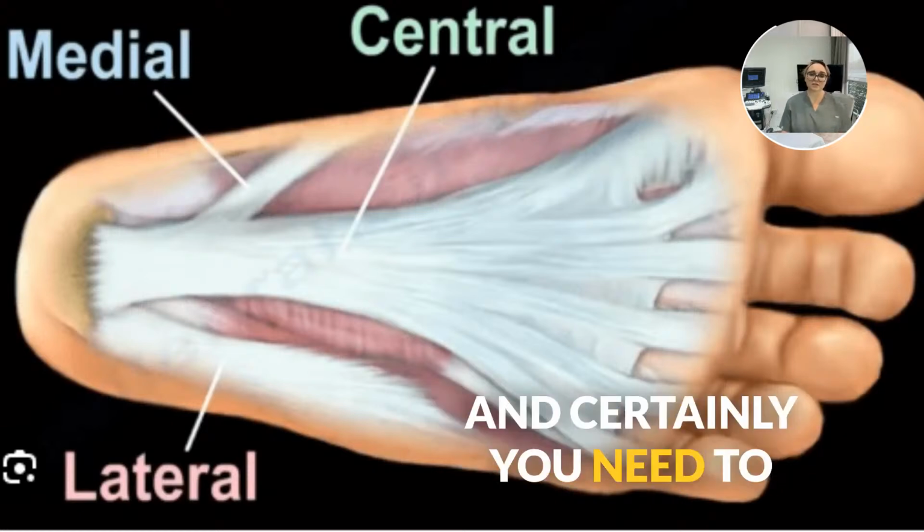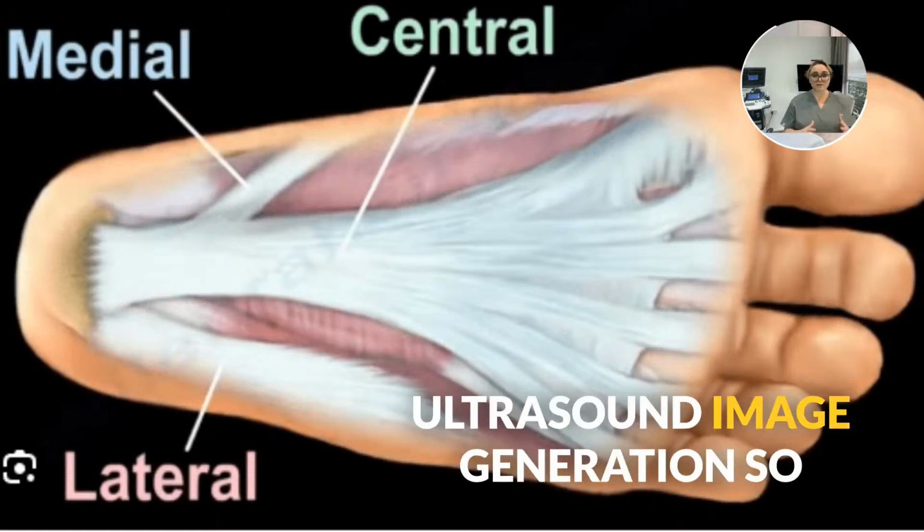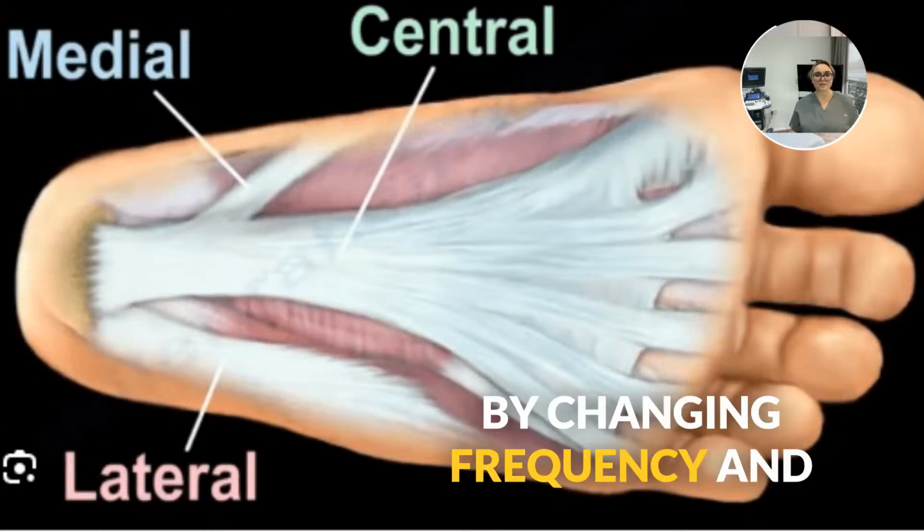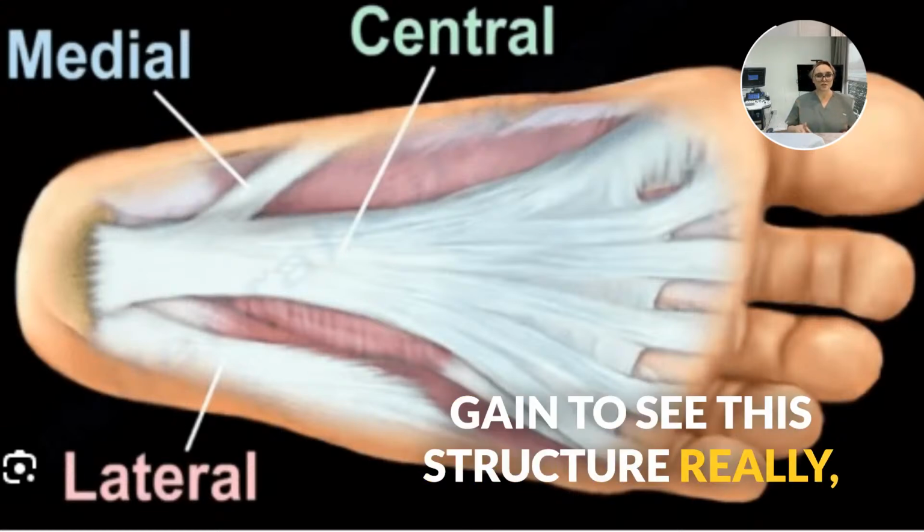And certainly you need to understand the physics of ultrasound image generation so you can optimize your machine by changing frequency and gain to see this structure really, really well.